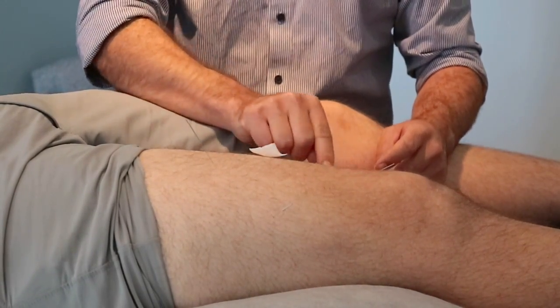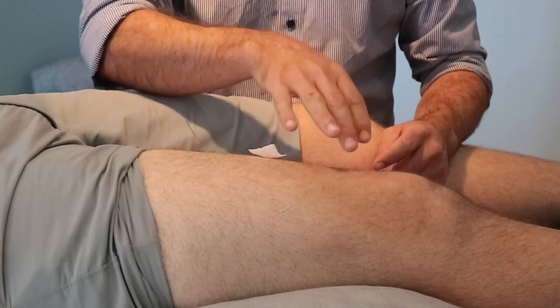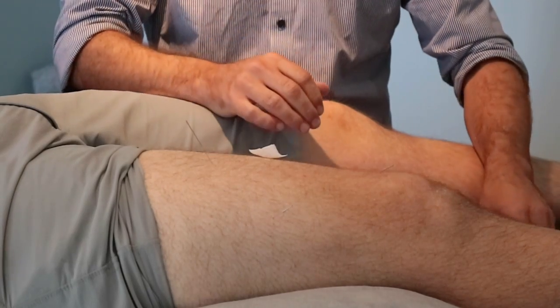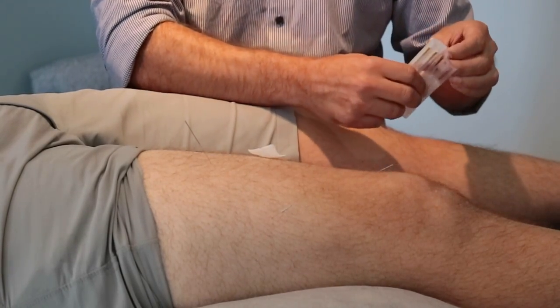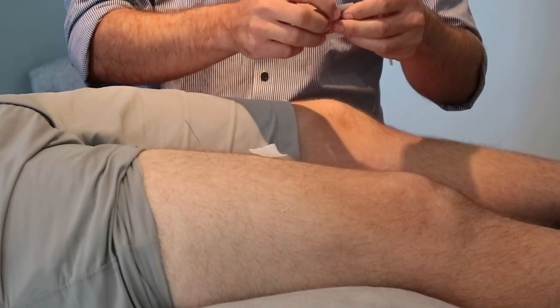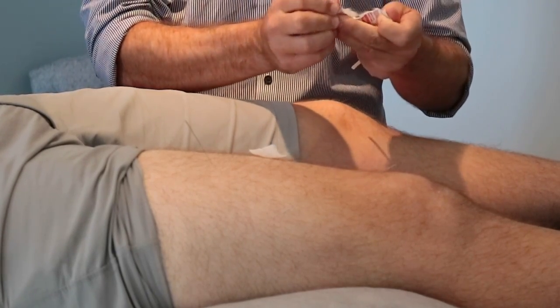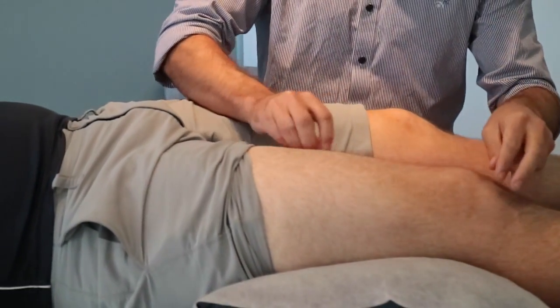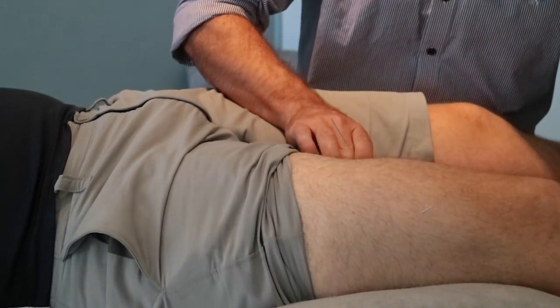So this is the region that we're looking at. It is that region where when you stick your finger in, you actually feel quite a large amount of discomfort. We're going to be moving on to the vastus medialis now as well. Now you can move into more of the adductors, etc., as you move through, but we're going to be sticking mostly with the quad muscles, the quadriceps.